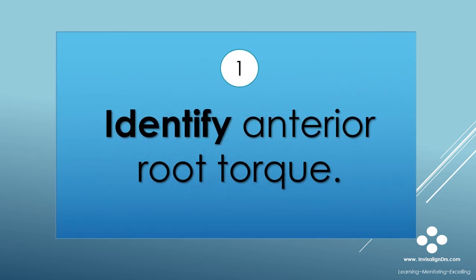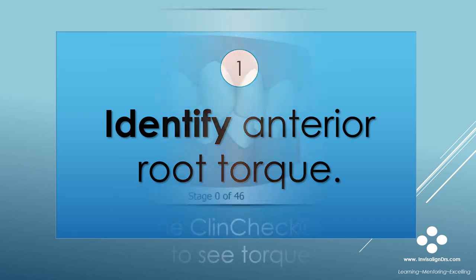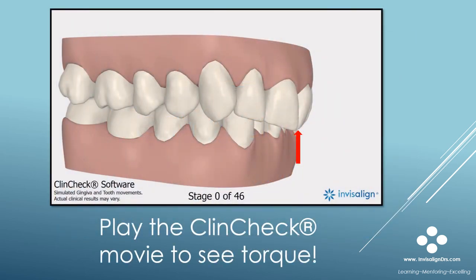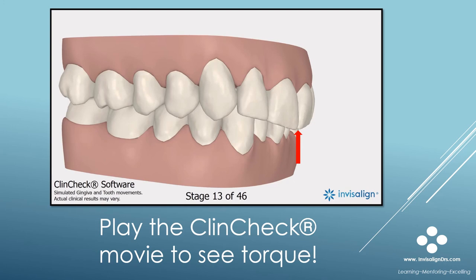So how do we determine if root torque is occurring in a ClinCheck? Here's a patient I've treated. Note that tooth 9 is tipped lingual to begin with. When I play the ClinCheck movie, you will see lingual root torque occurring with tooth 9. Note that the buccal-lingual position of the incisal edge does not change much — so that's root torque.